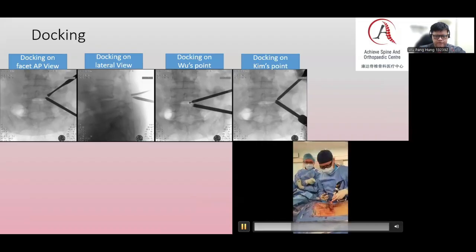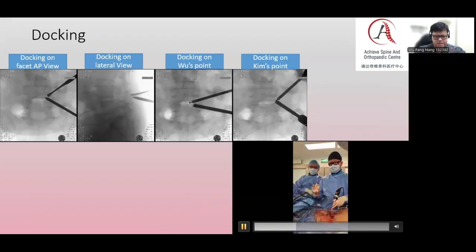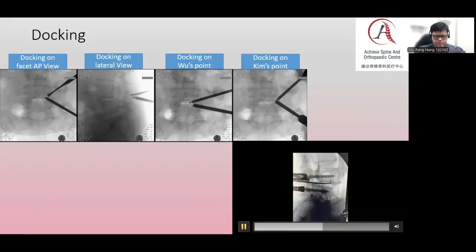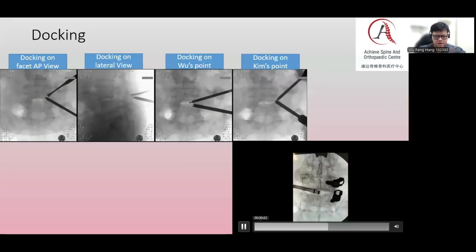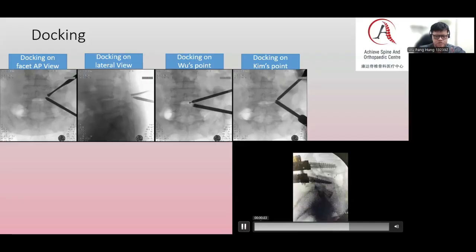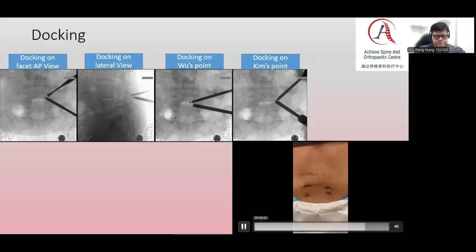The advantage of endoscopic surgery is that you can actually visualize the big bone pieces that can be removed in the instrumentation. So you can see the inferior articular process can be removed in chunks, and that can be used as bone autograft. Then we subsequently can insert the typical cages that we use in fusion, as well as trials, dilators, and bone harvester can be used as bone graft.